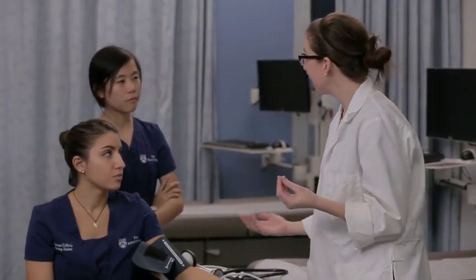Could I interject? I know that sometimes when people are first starting to learn to take blood pressures, they watch the gauge and watch the needle moving. When they stop seeing bounces in the needle, they think they've achieved diastolic pressure — which is not actually correct. You've got to make sure that what you're really listening for is the stopping of sound. That's very important, not the jumping of the needle. Some people do use that as a rough indicator of blood pressure, but the most accurate way is to listen. And it takes some practice, which is why we'll be practicing here in the lab.